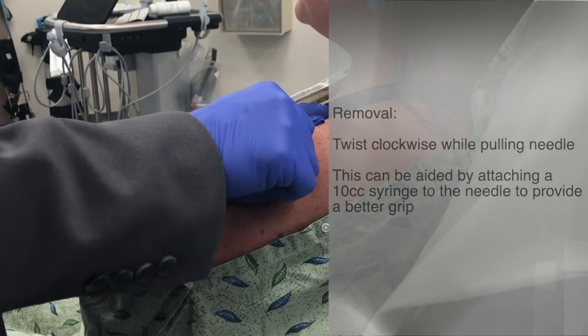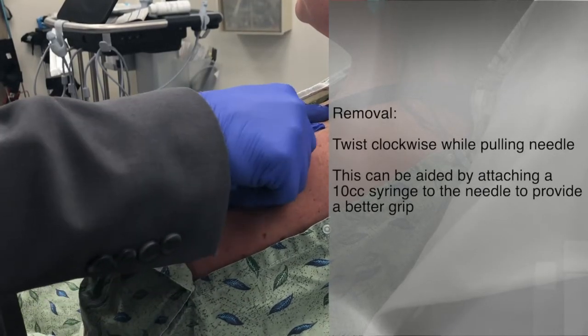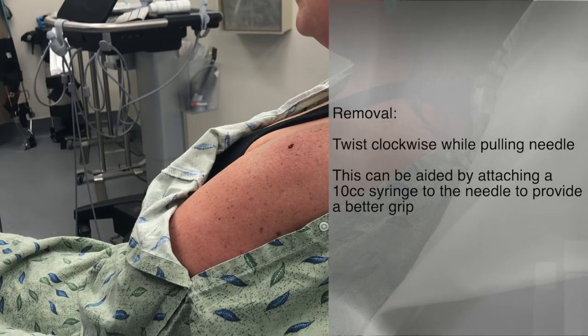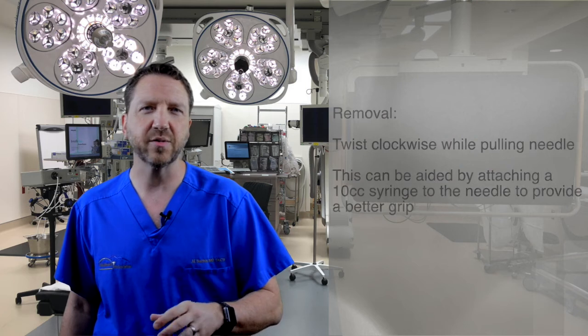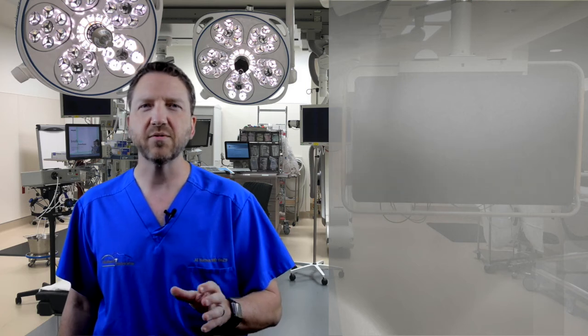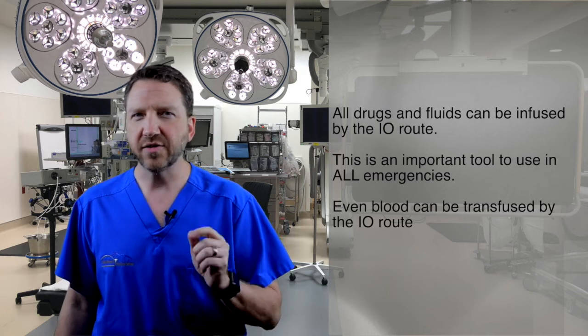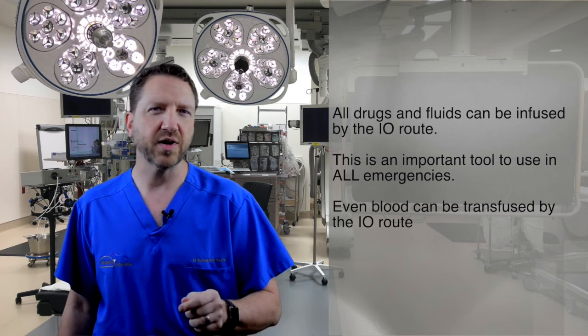Removal is accomplished by pulling straight out and rotating the access needle in a clockwise fashion. It may help to place a 10 cc Luer lock syringe onto the access needle to provide a better grip. Finally, remember that all drugs can be infused by the IO route. This includes using the IO for blood transfusions.